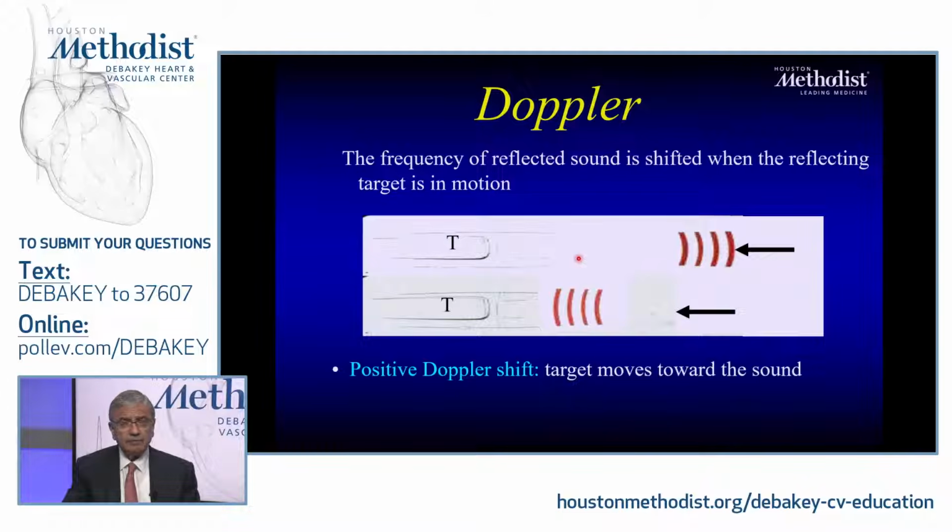Interestingly enough, also in an application of the Doppler equation, if you're perpendicular, meaning if you're a little bit away from it and perpendicular to the trajectory of this moving object, you're going to hear the same frequency. It's not going to change. So if you're further away from the train and the train is perpendicular to where you are, basically you're going to hear it the same. It's not going to change the tone or the frequency of that sound.